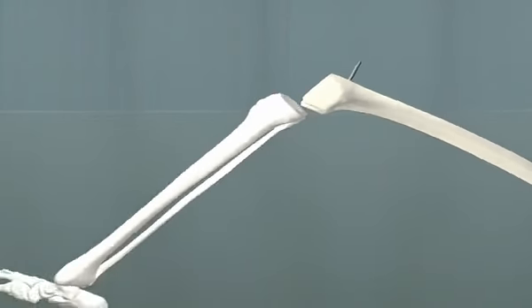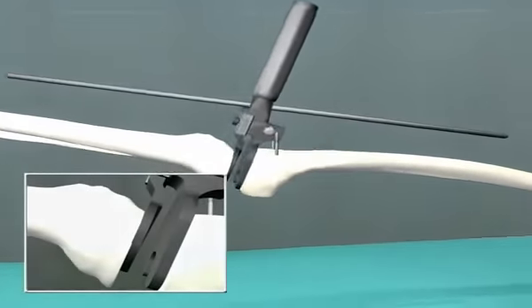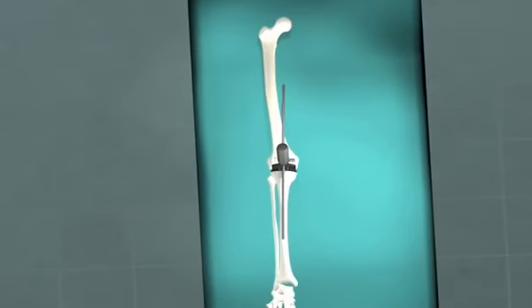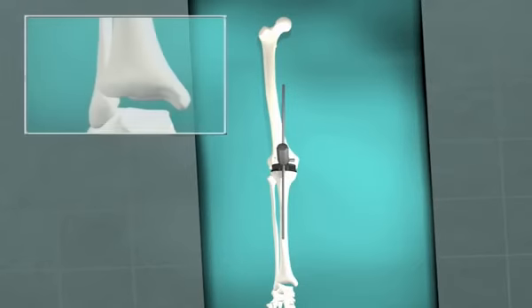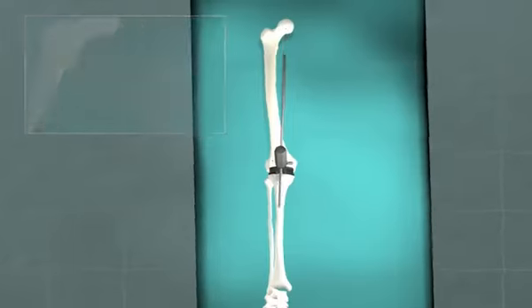The knee is then brought into full extension, and the spacer block used for the flexion gap is inserted between the femur and tibia to assess the extension gap. Axial and frontal plane alignment can be assessed using the alignment rod, which is brought to the center of the femoral head down to the center of the ankle joint.